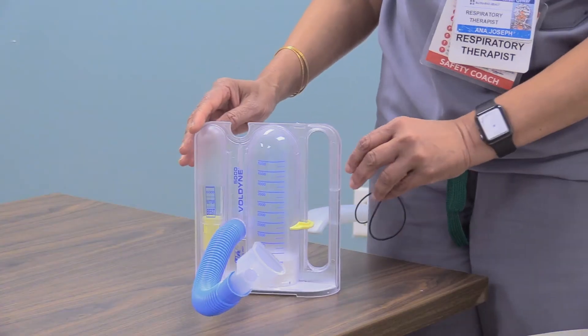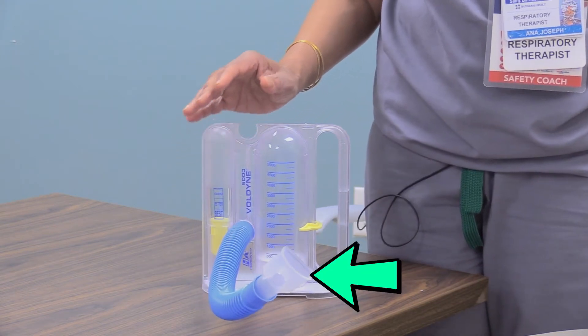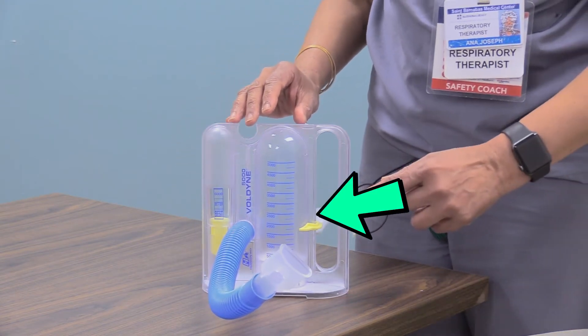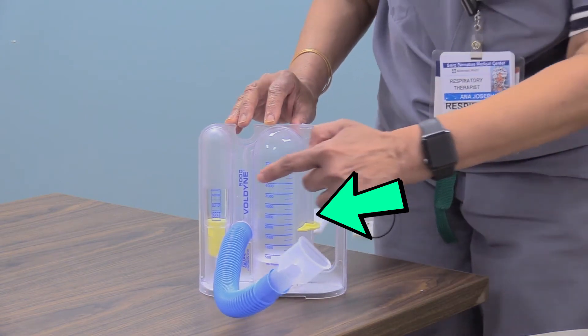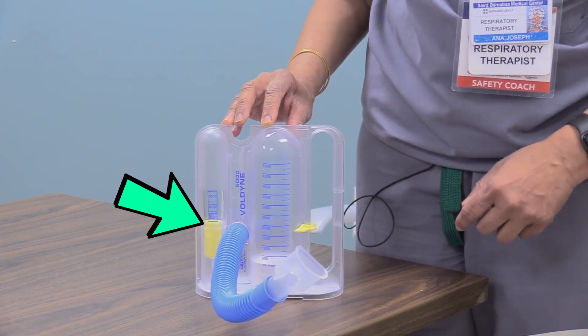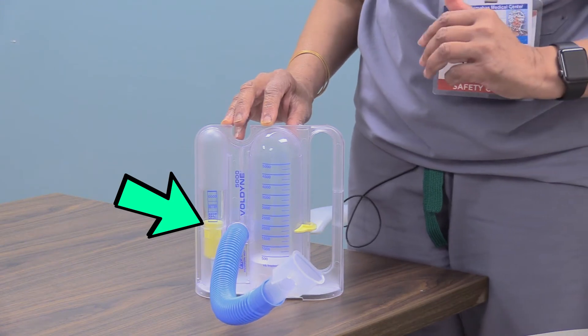The incentive spirometer helps to protect your lungs from complications after surgery from being less active. It helps by expanding and exercising your lungs. Your incentive spirometer consists of a mouthpiece, the main chamber that has a piston and a goal marker that will tell you of your progress. It also has a flow indicator that tells you if you're breathing too fast or too slow.